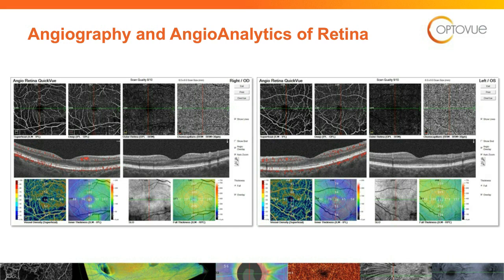And you can see where the damage is and where the retina is thinned out. But if you just go to the left of that, you'll see where the vessel density is thinner there, those big blue lakes, and it just matches up. And again, you're able to measure that, and that's going to be exciting whenever we're able to compare next year when she comes in, as a progression to see how her vessel density is holding up.